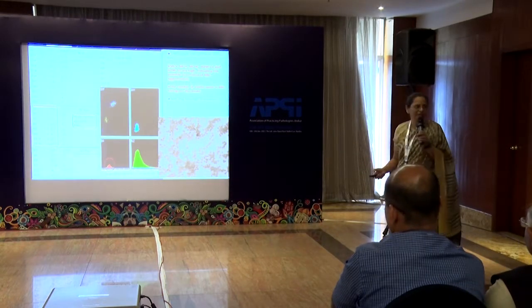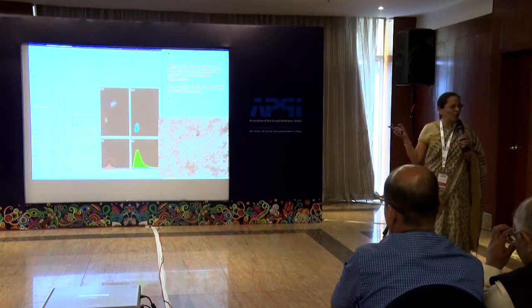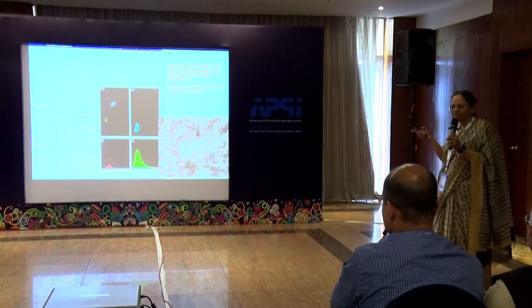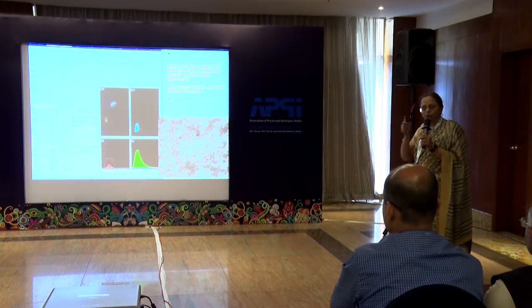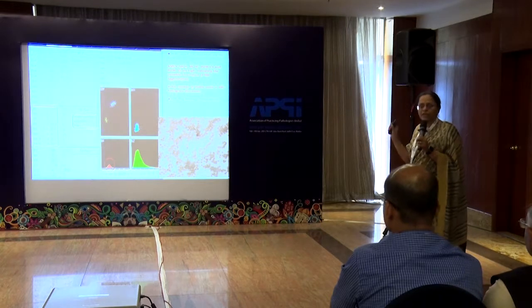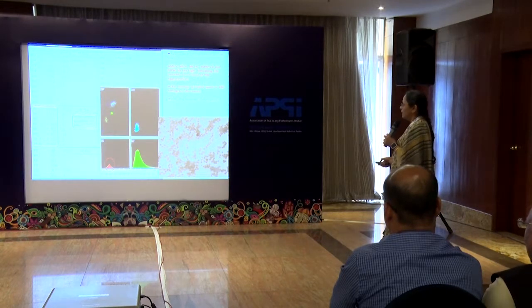So history again is important, and your morphology. Because of your morphology, you picked that up and your report doesn't look so awkward. 13.6, 116 MCV. It looks very funny, right? So you won't sign out that report if you had looked at the smear. You would put a clause saying check for history of transfusion and also evaluate for megaloblastosis.